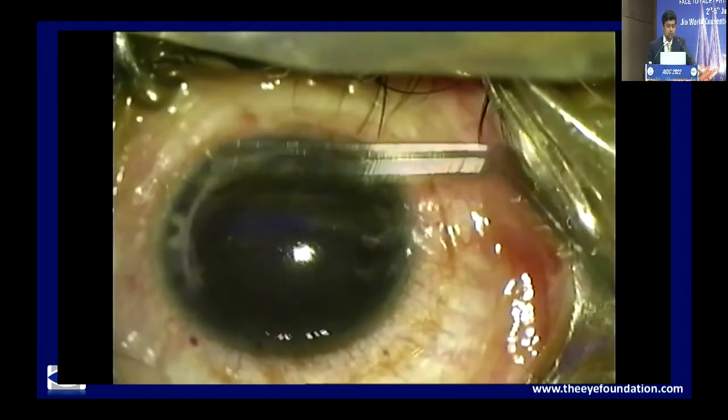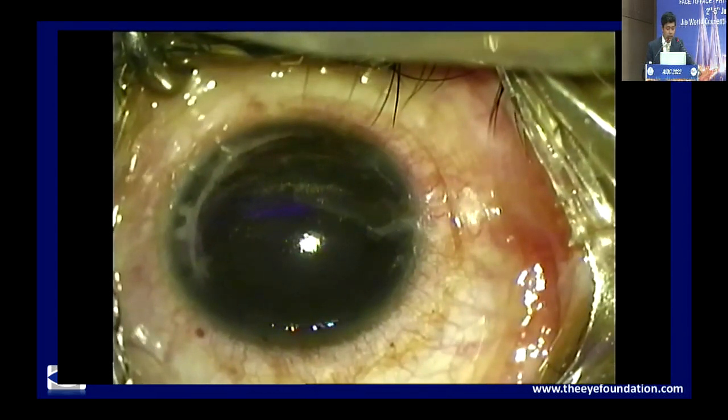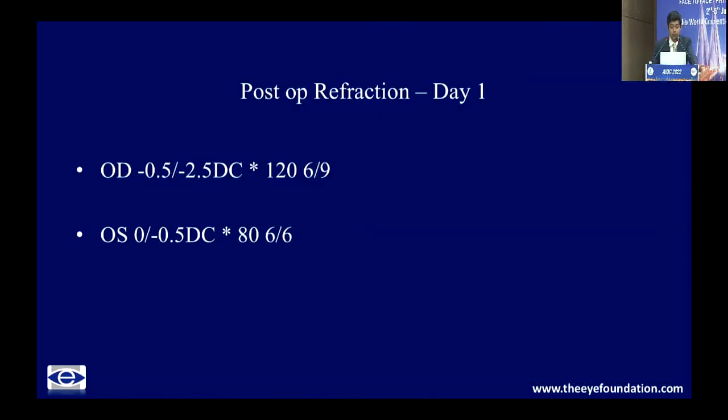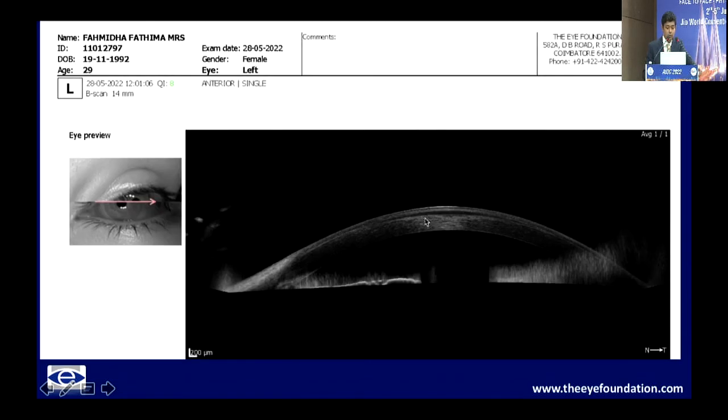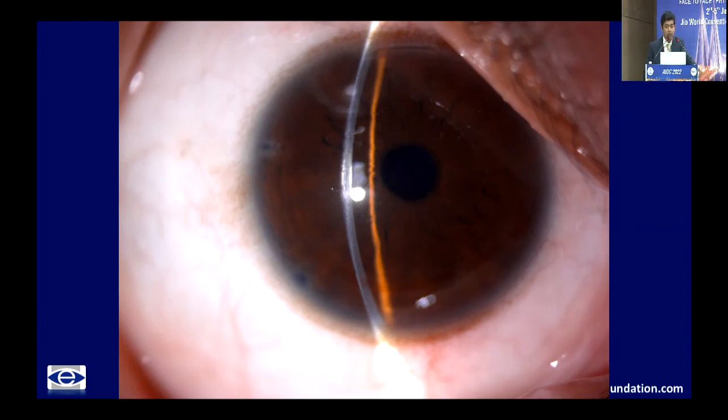Although I did my best to center, if you look at the post-operative period, the refraction was good. The patient was happy. It was just the residual cylinder, and I anyway told the patient that we'll be doing a PRK as a subsequent procedure for correcting the astigmatism. We had matched the similar power as far as the smile lenticule was concerned, and this is the AS-OCT 2022 showing that interface gap where the lenticule has been inserted, and in both eyes you can see it, and it's almost very difficult to make out unless you do a dilated retroillumination.